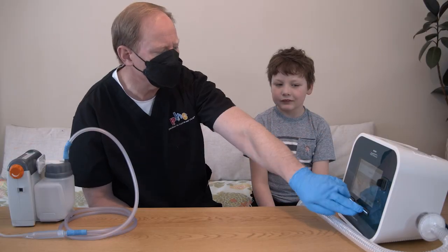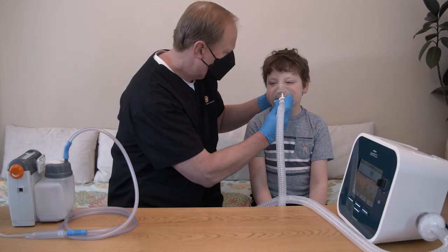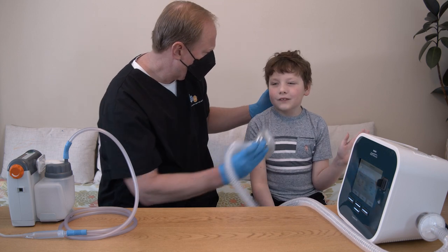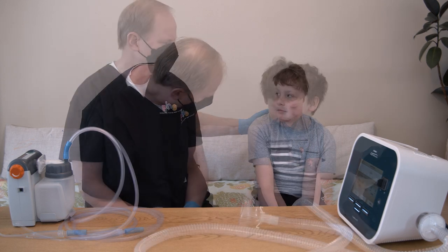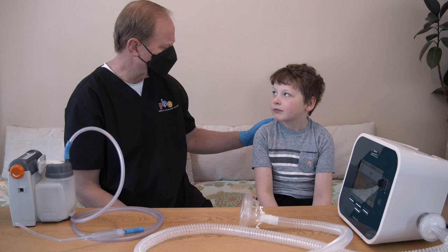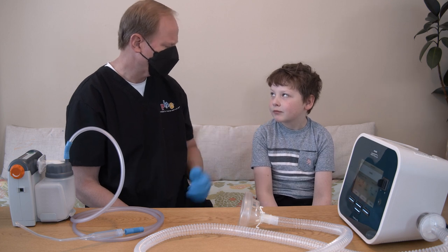If your child experiences dizziness, high heart rate, or chest pain, stop the therapy. If symptoms continue during the next cycle, contact the healthcare provider. Allow your child to rest and breathe normally for 30 seconds to 1 minute between cycles.